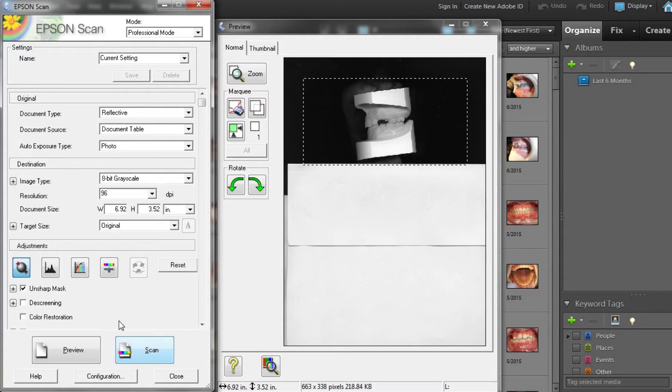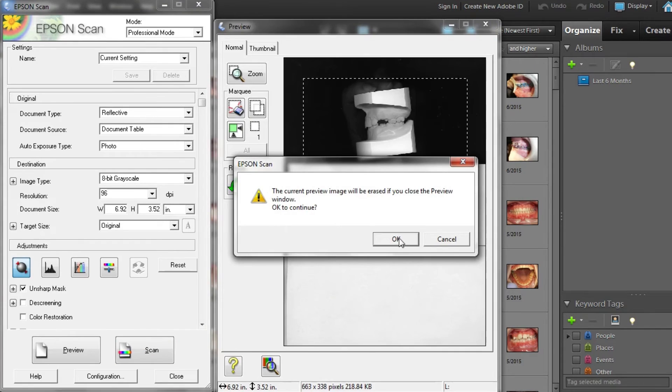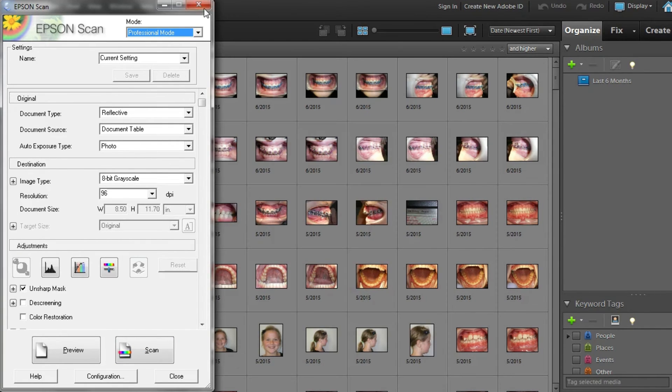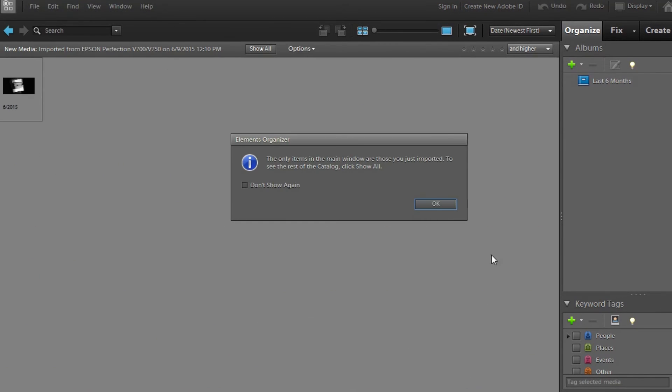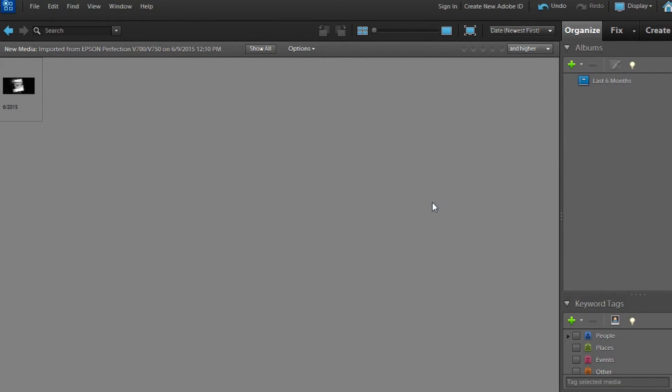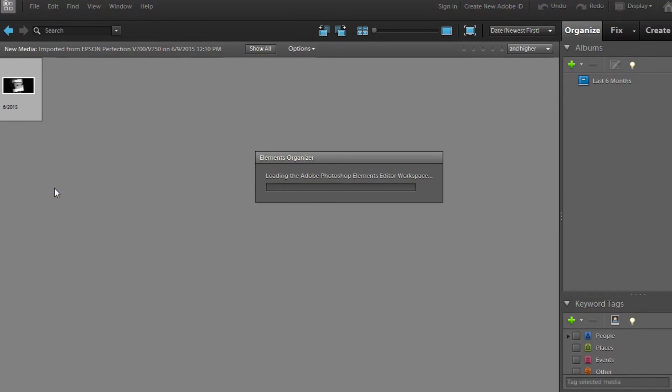Now that you have the images imported, exit out of the scanner window and the preview screen. This will take you back to Photoshop where you can rotate and crop the right and left model views and save. Take care.